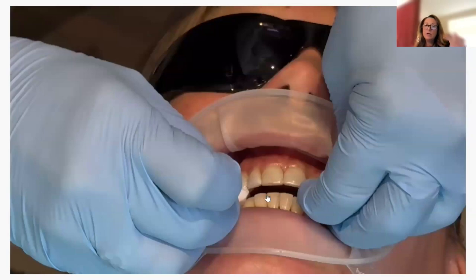And here is where I usually will have the patient open up, and I'm holding it, and around the attachments, I push back the extra material, if they have overflow, away from it. That way I can pop it off with a scaler, or take a little pointed enhance or Shofu point.